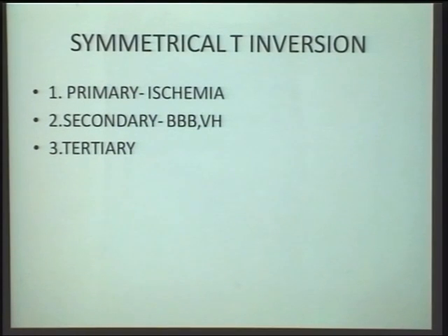Symmetrical T wave inversion is primary ischemia, secondary due to bundle block or ventricular hypertrophy, tertiary change.